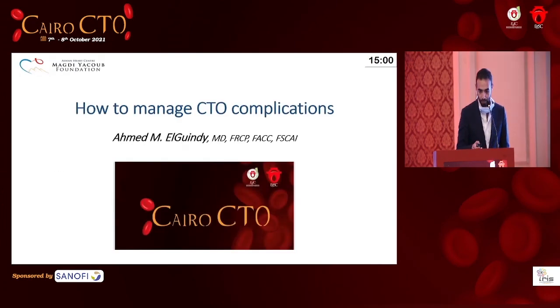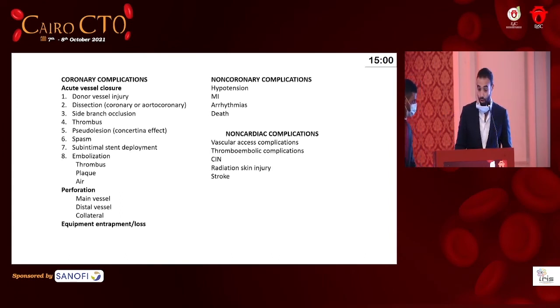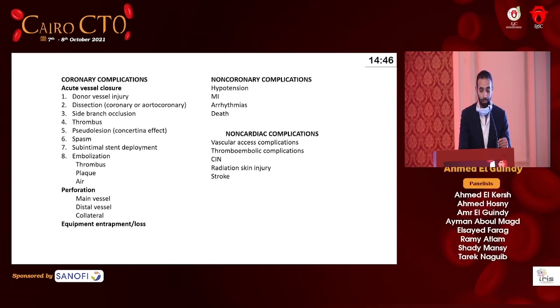So these are my disclosures to get them out of the way. This is how we look at complications during CTO PCI. You have a number of coronary-related complications related to acute vessel closure, which can have a number of mechanisms. We have perforations, one of the most dreaded complications, and equipment entrapment or loss.